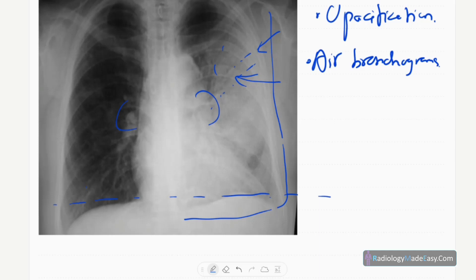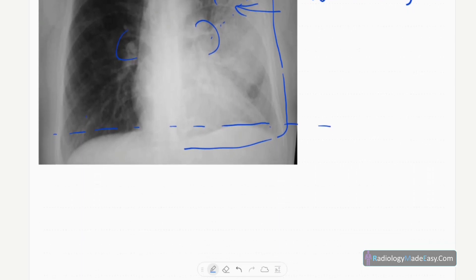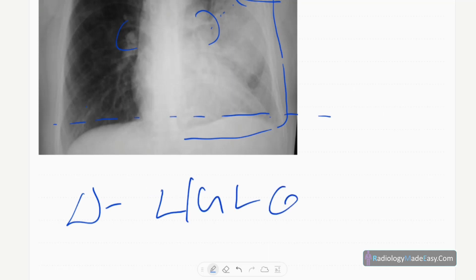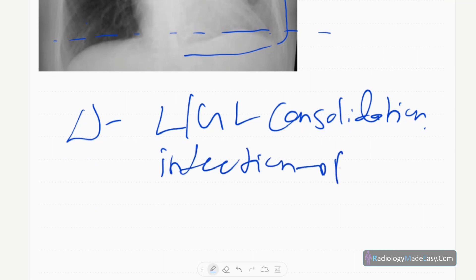So in this case, the diagnosis is left upper lobe consolidation, mainly due to infection causing pneumonia.